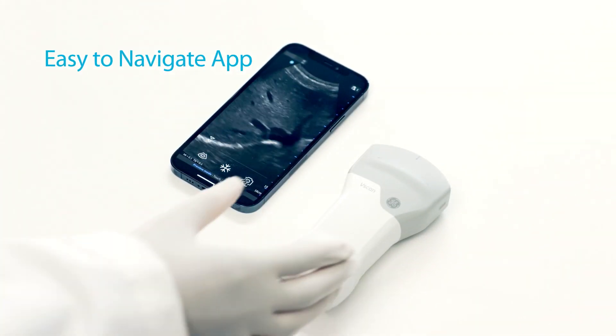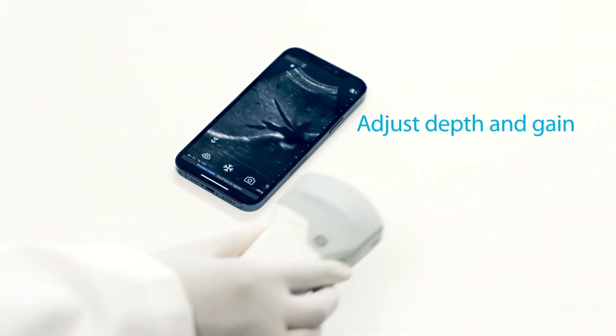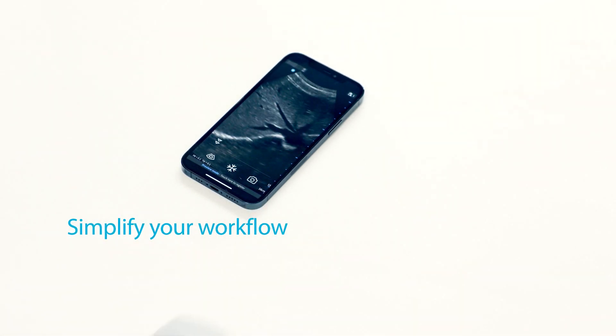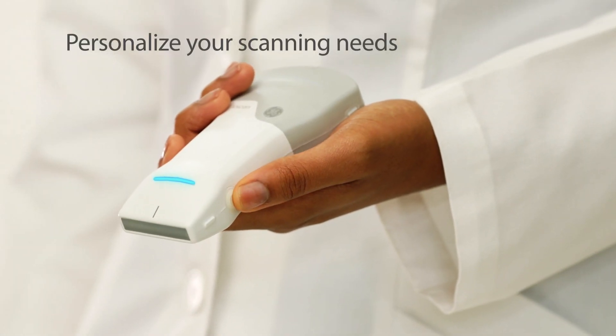vScan Air's easy-to-navigate app is designed to be used single-handedly, with features such as the ability to adjust depth and gain with a single swipe of your thumb. Simplify your workflow with features including a physical button that can be personalized to your scanning needs, such as freeze or store.